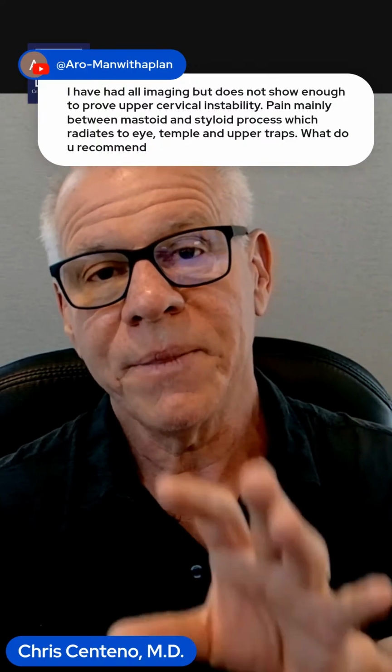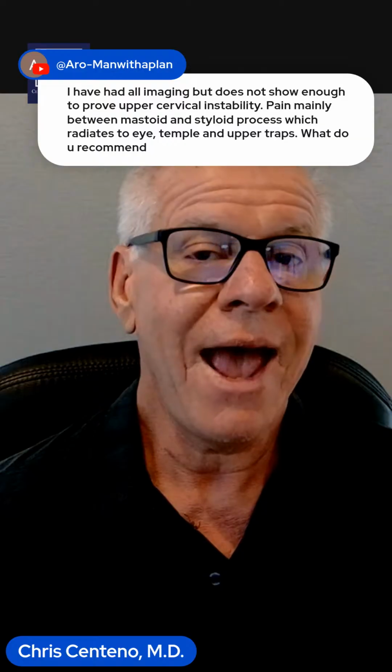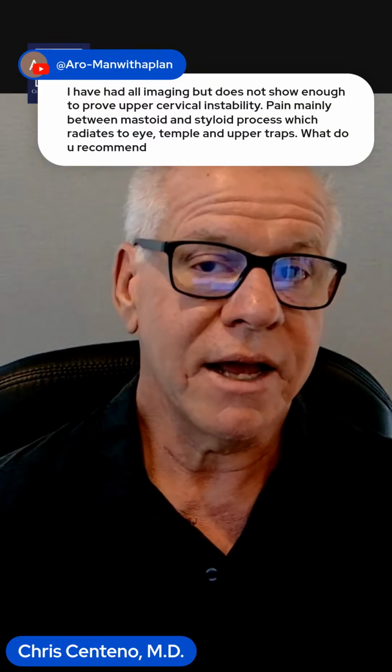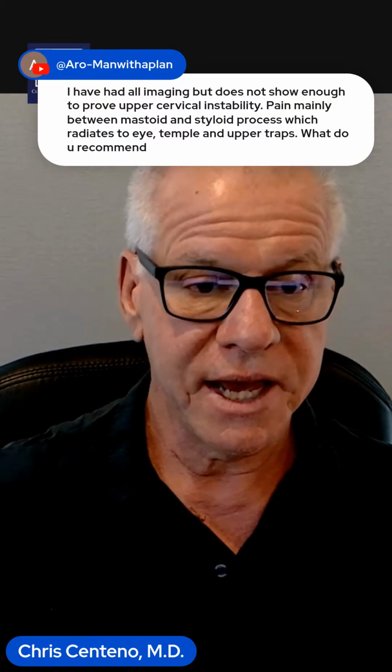At the end of the day, we're talking about what kinds of imaging are needed, and it's generally movement-based imaging. So for example, if all you've had is a live face up in a tube MRI or a supine MRI, that's really not going to help us get to CCI. So you could have it and it wouldn't show. So again, movement-based imaging is key.